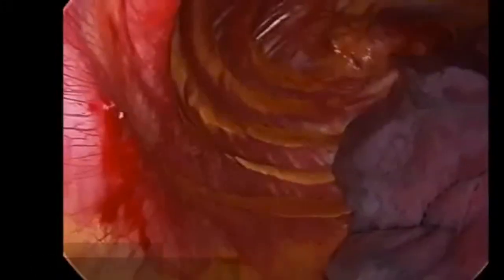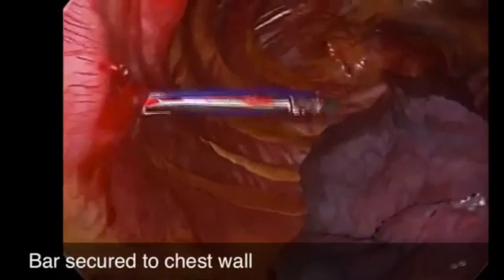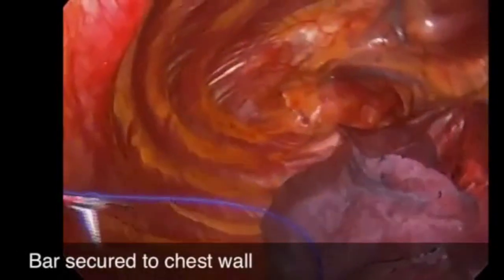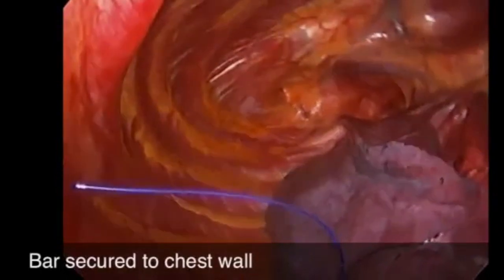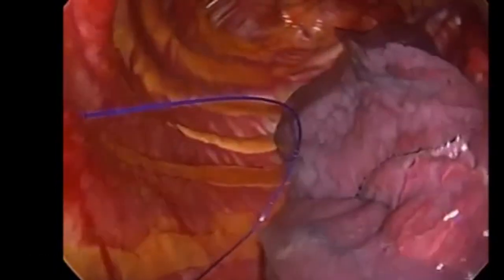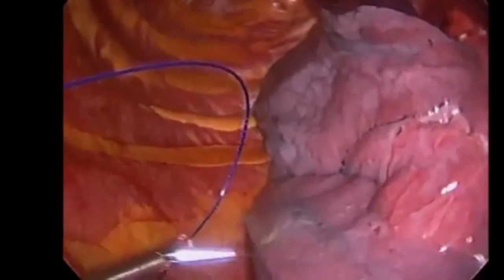The right side of the bar is then secured using a single zero prolene suture placed via a Carter Thompson device. The bar is then anchored to the rib using the suture. The left side of the bar is anchored to the chest wall using a bar stabilizer and a single stainless steel sternal wire.